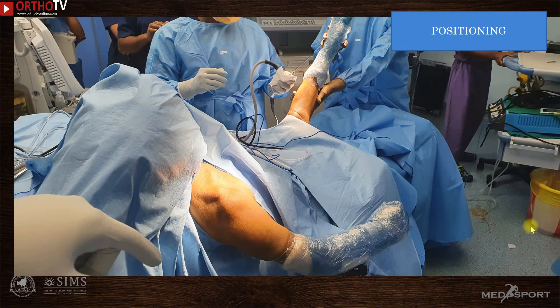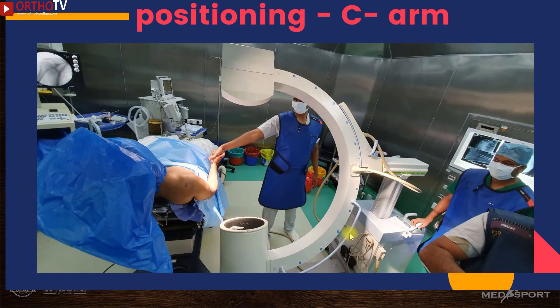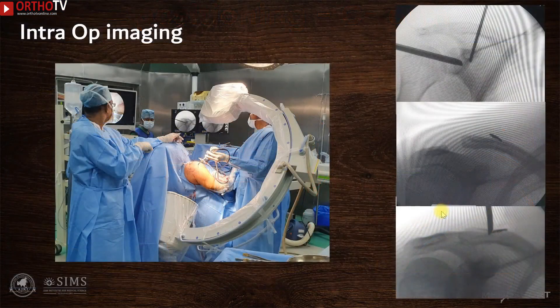This shows how the patient is positioned — in a semi-beach chair position. The opposite limb and knee are draped for harvesting the semitendinosus tendon. It is very important to have good access to the C-arm, because various steps such as drilling, button positioning, and reduction all need to be verified under C-arm guidance.